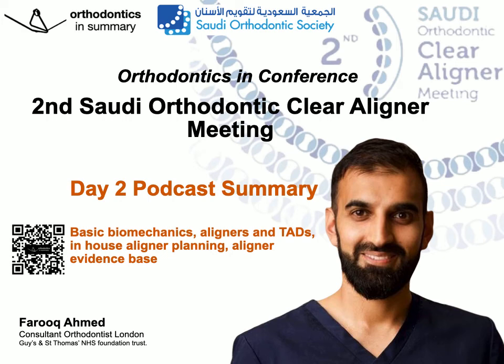We've got close proximity of plastic on plastic, but actually we've got the weakest aspect of the aligner at this cervical aspect. Also, Invisalign and some of the other companies, they're not adapted particularly well at the gingival margin. So on two accounts, we are unlikely to achieve torquing movements. One for the strength of the aligner, and the second is that we can't apply much force to the cervical aspect with the aligner itself.